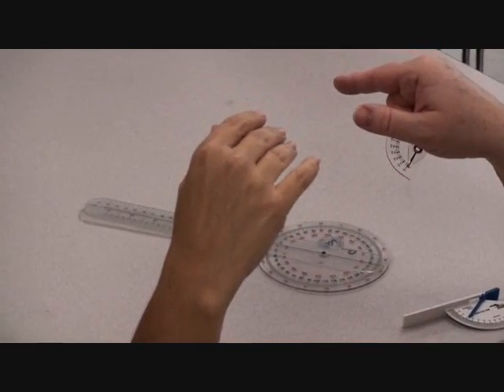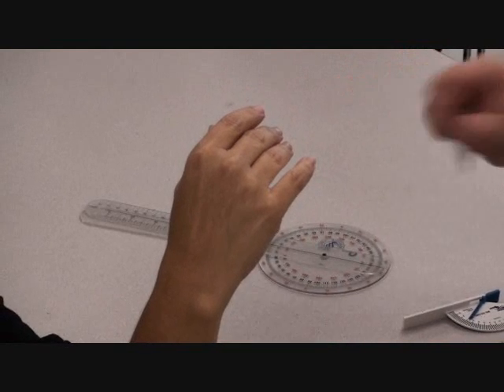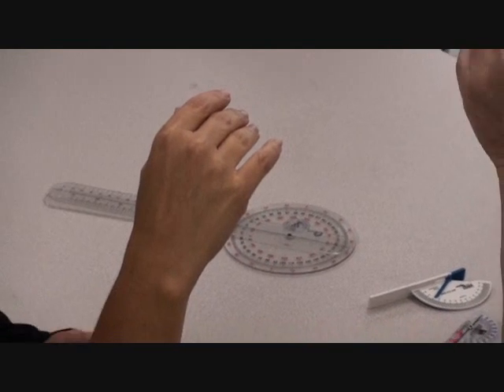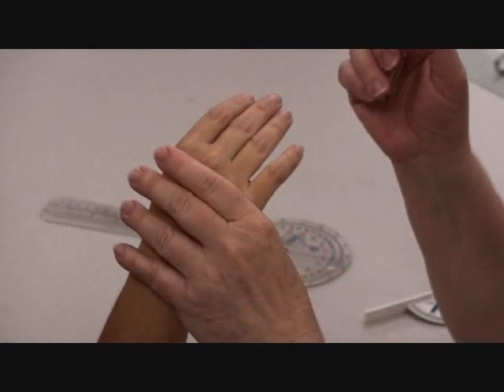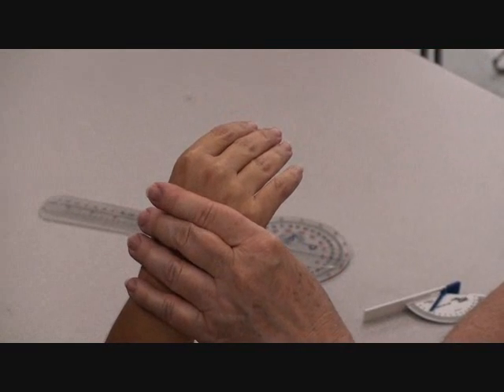It wasn't this group that had the person that had really marked hyperextension, where I said we actually took the goniometer over the back, because it was that marked. We might have to figure out and get that person in video.